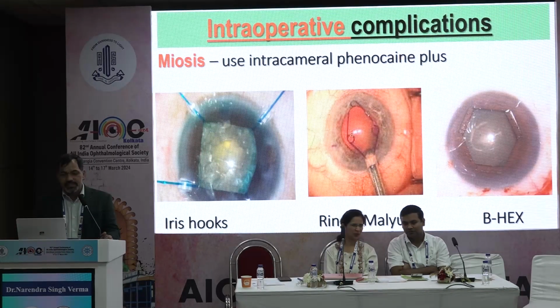For intraoperative miosis, as you know, you can use iris hooks, rings like Malyugin ring, B-hex ring, whatever is comfortable in your hands.